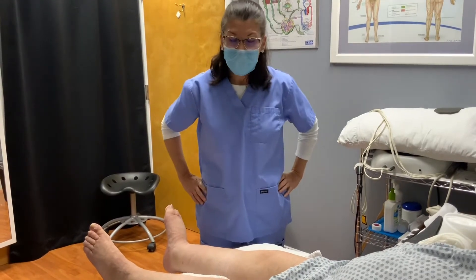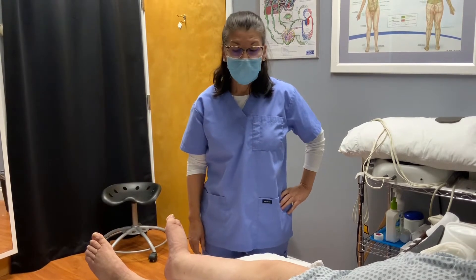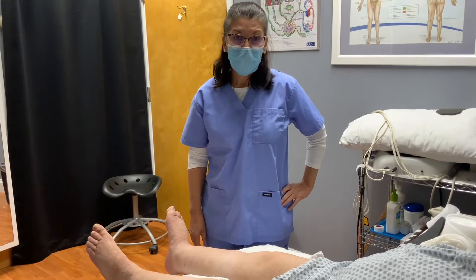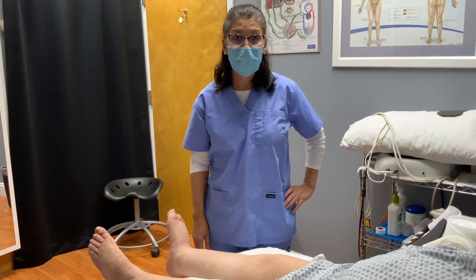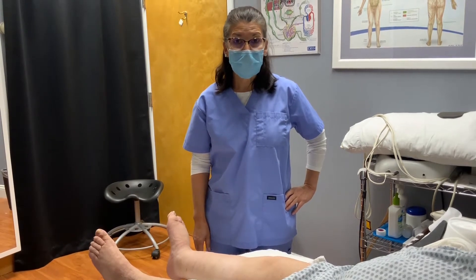Today I am going to demonstrate how to apply multi-layer bandaging on the lower extremity that has primary lymphedema. I'm going to go through the different layers that are involved. Of course, it varies from patient to patient depending on the severity and what the needs are and functionality of the patient.